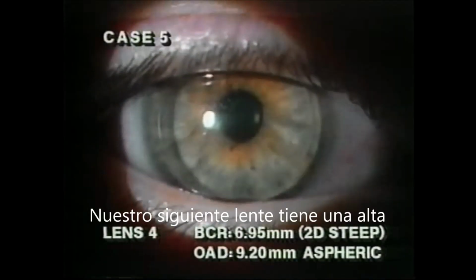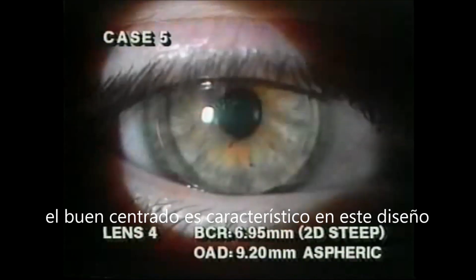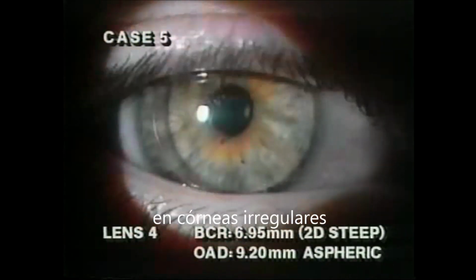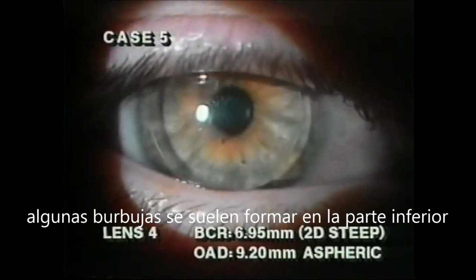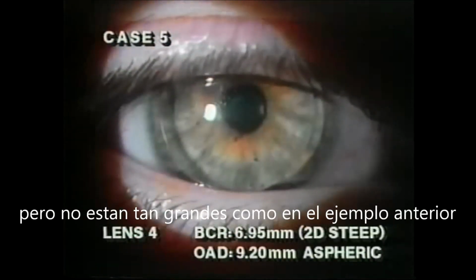Our next lens is a high eccentricity aspheric design. The good centration is characteristic of most aspheric designs fit on irregular corneas. Bubbles are present along the inferior lens edge, but they aren't as numerous as with the previous examples.